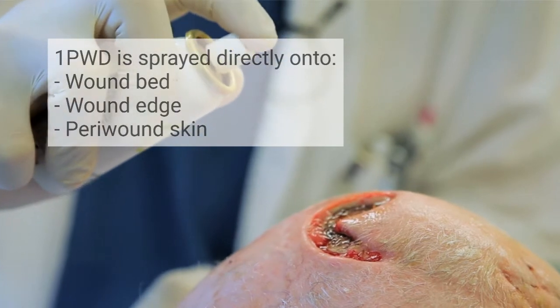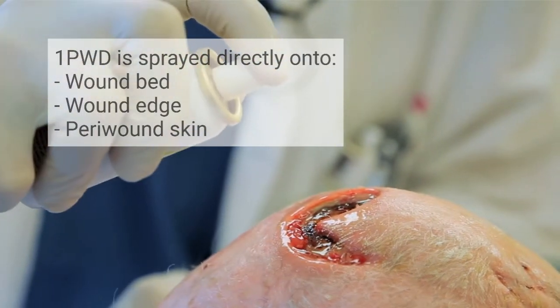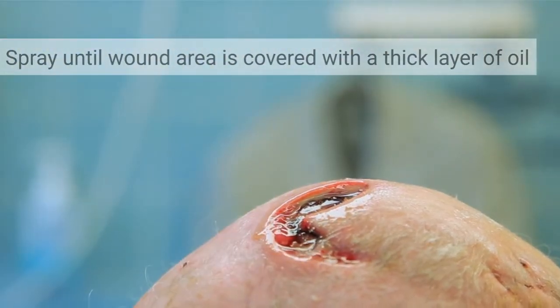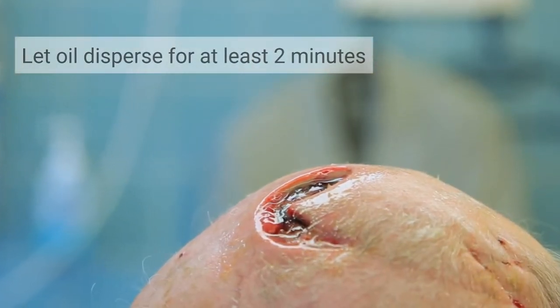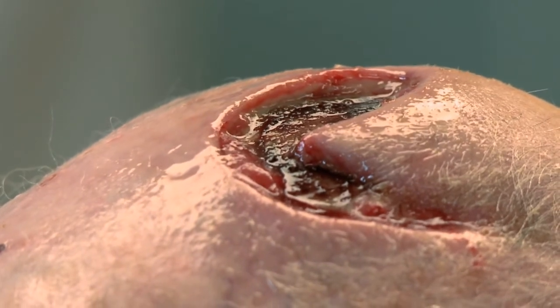One is then sprayed directly onto the wound bed, the wound edge, and the peri-wound skin until the wound area is covered with a thick oil layer. Let the oil disperse for at least two minutes until you see an even oil layer over the wound and the wound area.